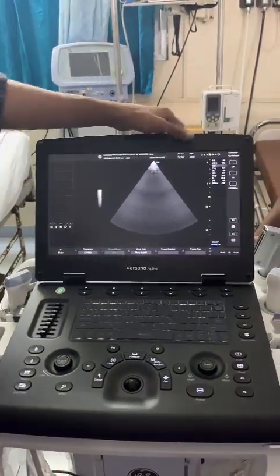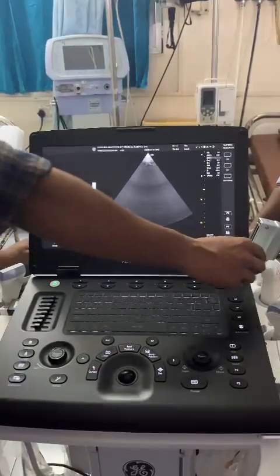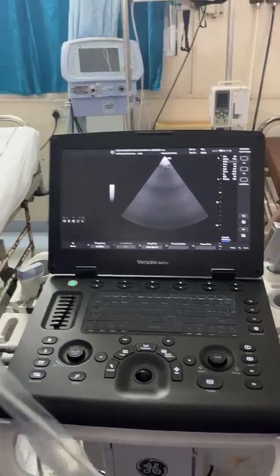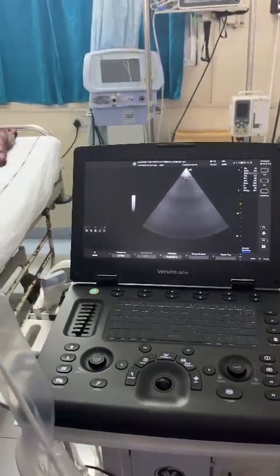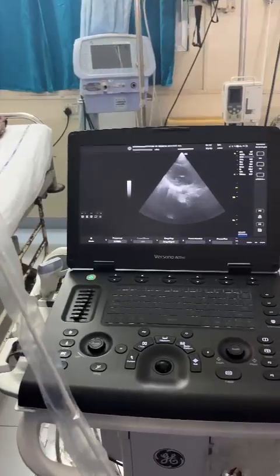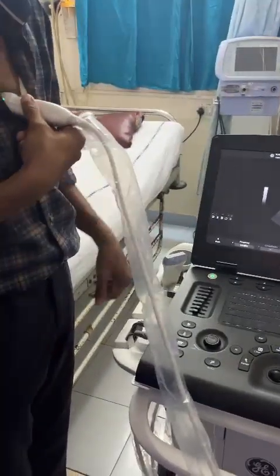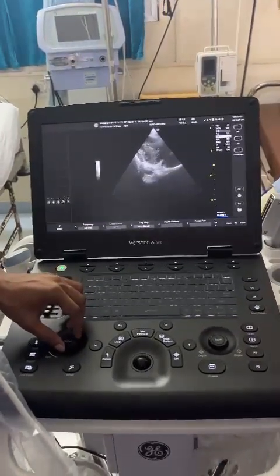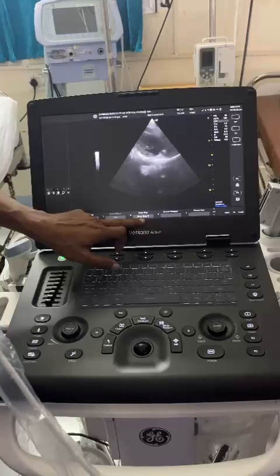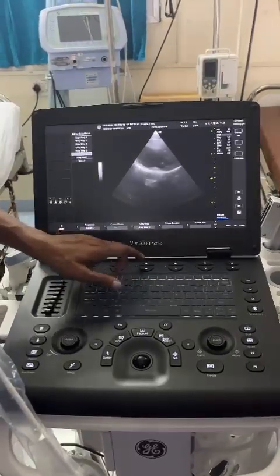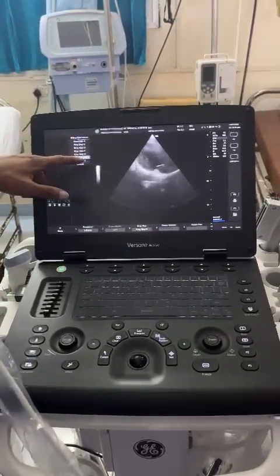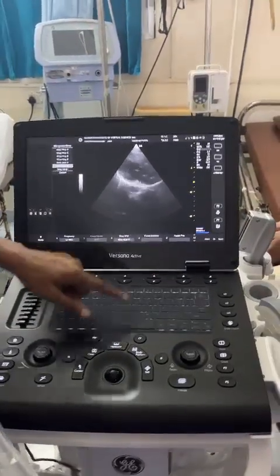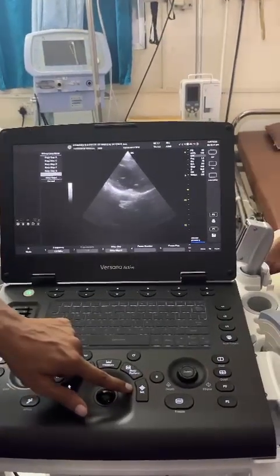After selecting your cardiac probe, you can do a scan. You can just change the gain to your requirement. Here is our gray mapping — whichever grayscale you feel is good for your site, you can select that. And this is our set button, like a select button.